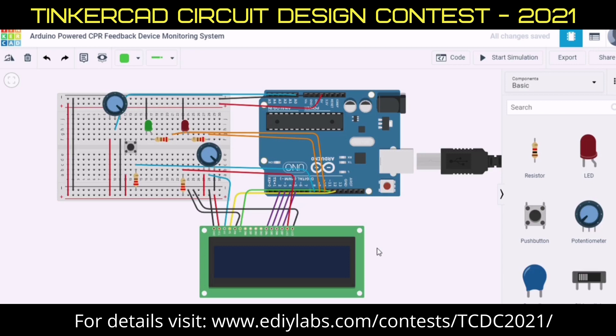First of all you have to know what is CPR. CPR is a critical life-saving skill that requires practice to perfect. This Tinkercad project adds real-time feedback to CPR management, and it includes a depth and chest recoil indicator as well as a CPR cycle counter.